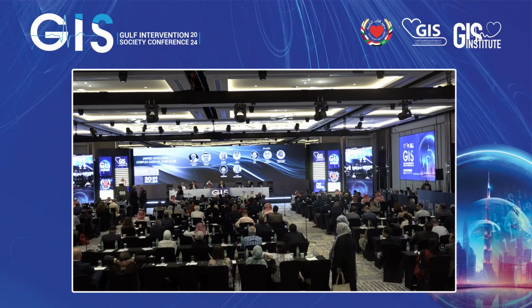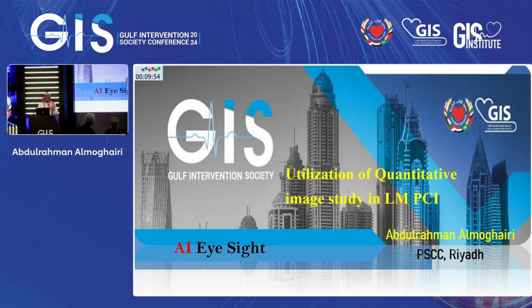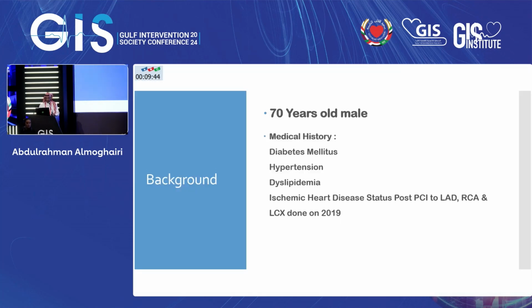The case is the one I'm going to share with you. It's some sort of discussion generated rather than the complexity. It's part of our daily practice to see this kind of case. This is a 70-year-old gentleman who had multiple medical comorbidities, and he had PCI in the past.